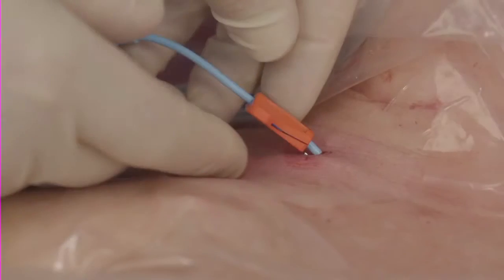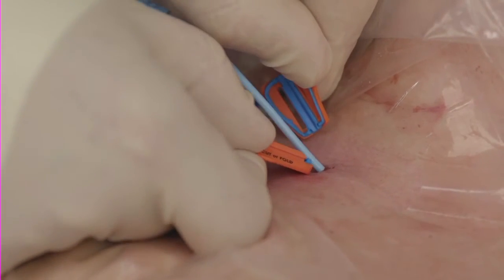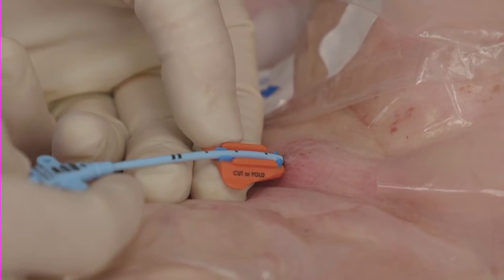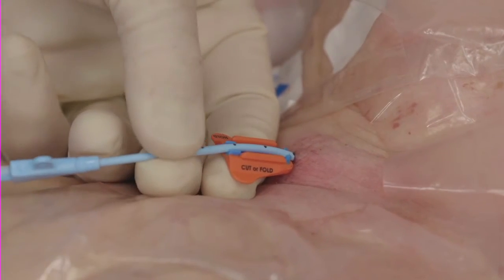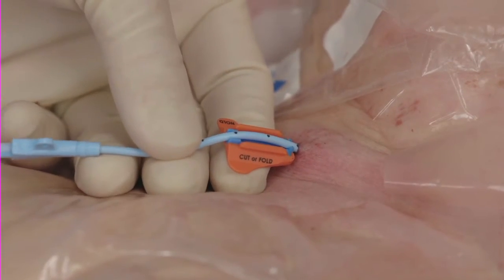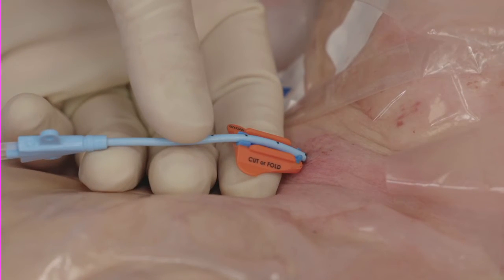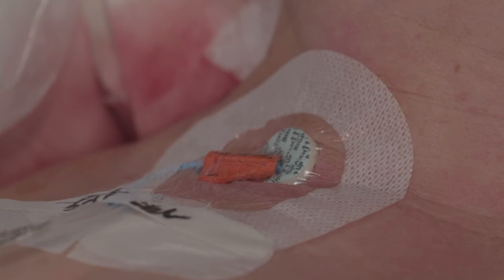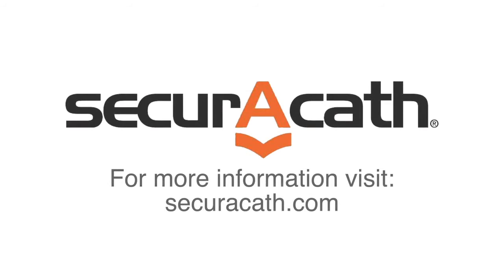If catheter adjustment is necessary, simply remove the SecuraCath cover, pull the catheter back, make sure the catheter and SecuraCath are clean and dry, and then replace the SecuraCath cover. Re-dress per hospital protocol.